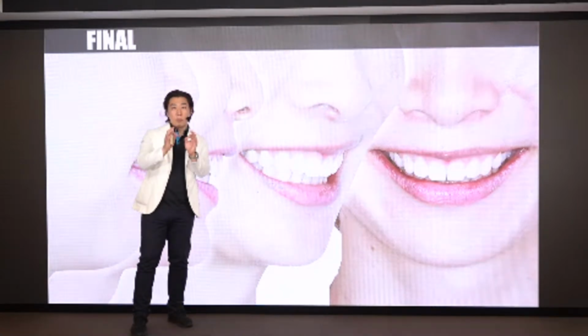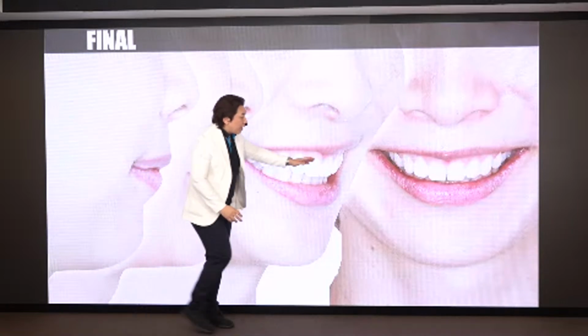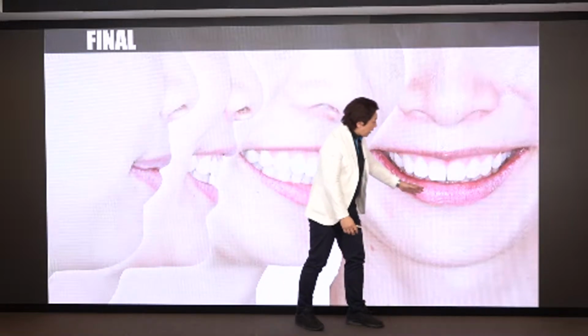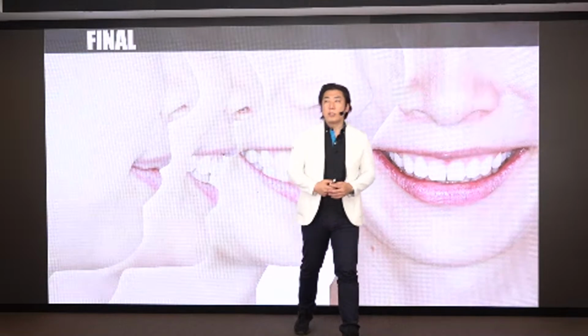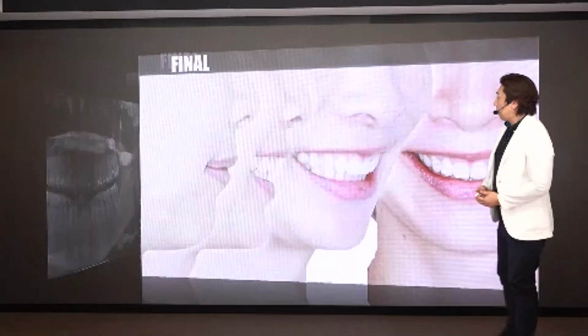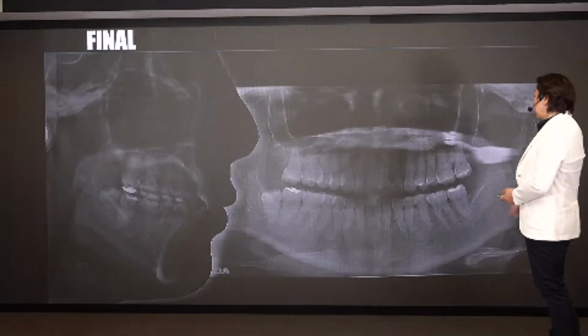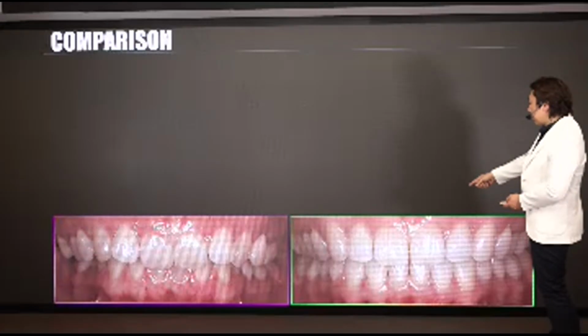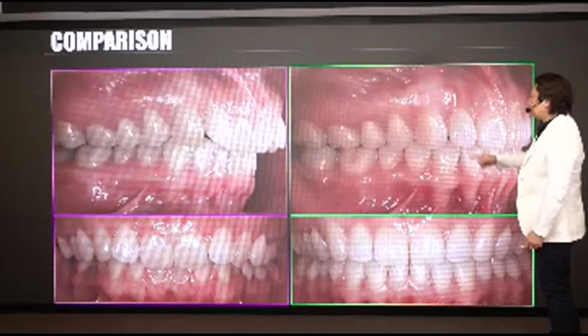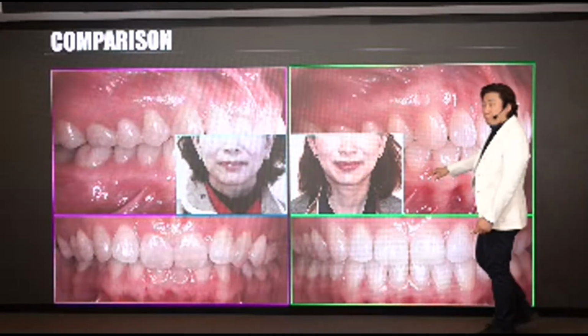Initially, I focus on which position is good for this patient: smiling, the canine position, and the midline. Initially I plan this position, then alignment. Have a look. This is the OPG and the cephalometrics. Tooth alignment is good. Comparison of initial and final, front side and right side, and the smiling.